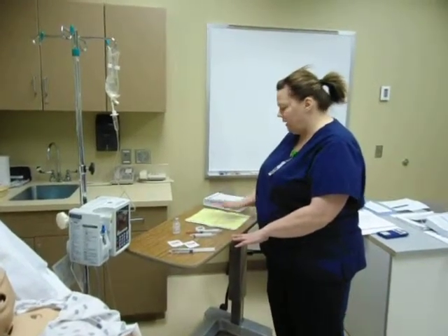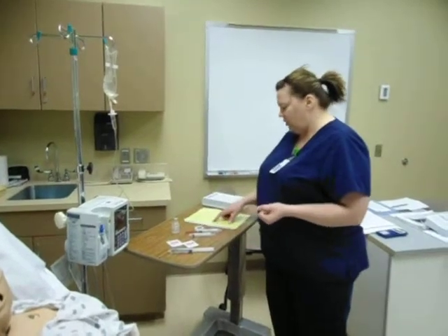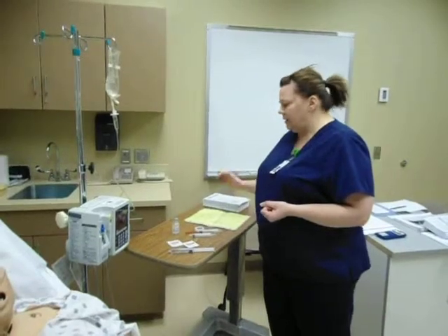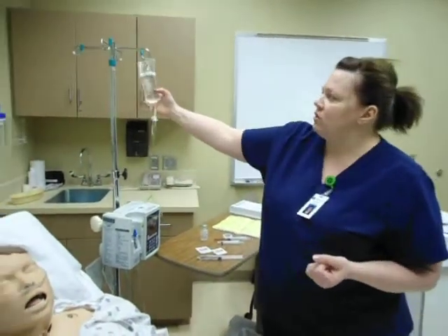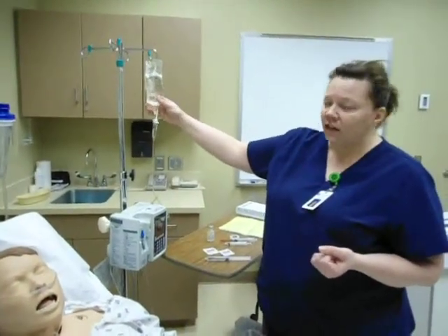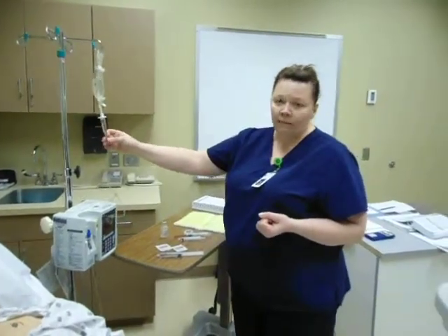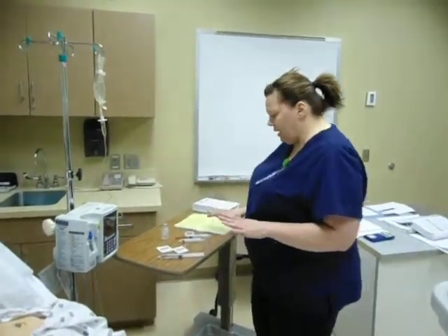my book, done all my calculations, looked for the allergies. This patient is allergic to morphine, and this patient also has D5 half normal saline running, and the Verapamil is not compatible with that. So I know that right now.